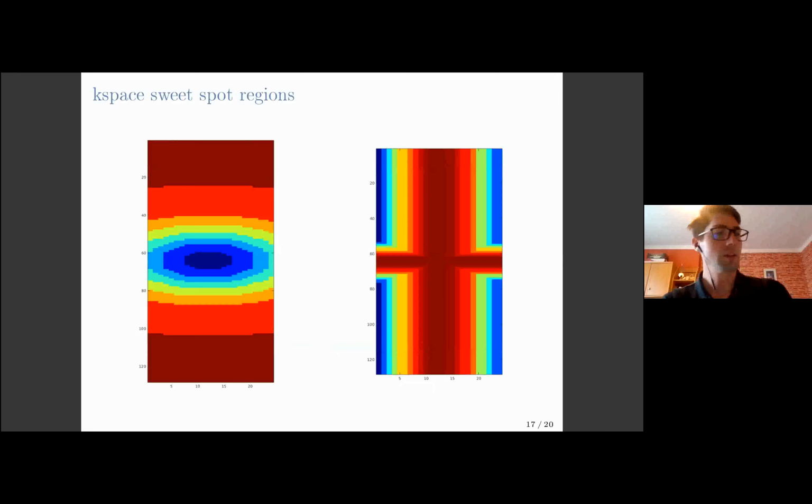And then we thought that, beside that, perhaps there are only some particular regions in the K-space that are the most sensitive to motion. So we checked those two funny shaped regions. So the ring ones on the left and the cross one on the right. And for the crosses, we took both, either just the data lying on the cross or just excluding the data on the cross and taking into account just the corners of the K-space, and repeated everything.